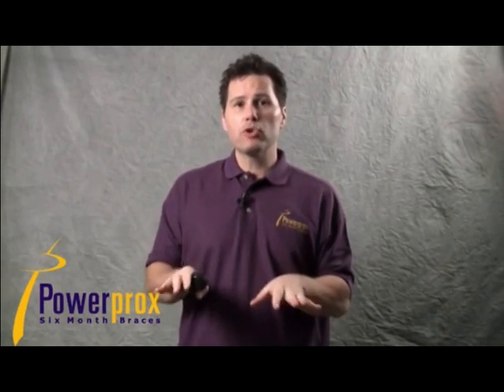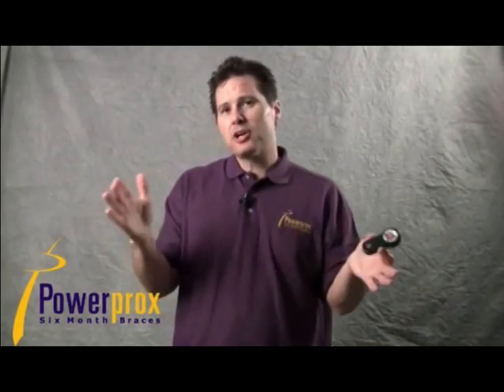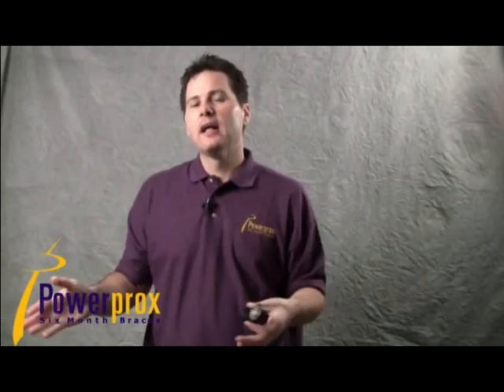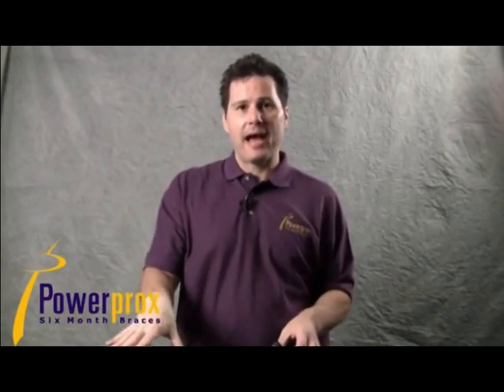Now, there's enough room in the bracket slots to fit both arch wires, typically not in the molar tubes, but in the bracket slots. So if I'm trying to bring down a high canine, my piggyback usually extends from second premolar, usually to contralateral central. As long as you're at least 2 teeth on either side, maybe 3 teeth on the anterior, you have plenty of anchorage to help bring that canine down very safely and efficiently.